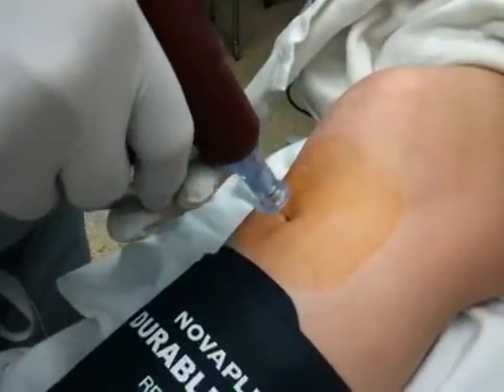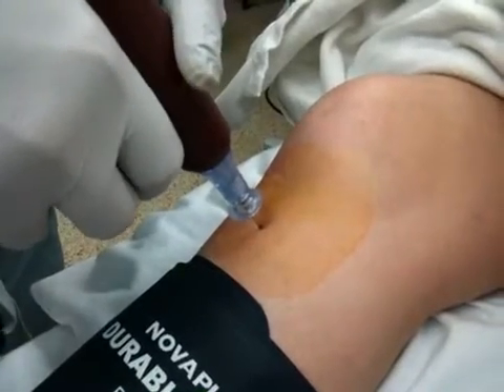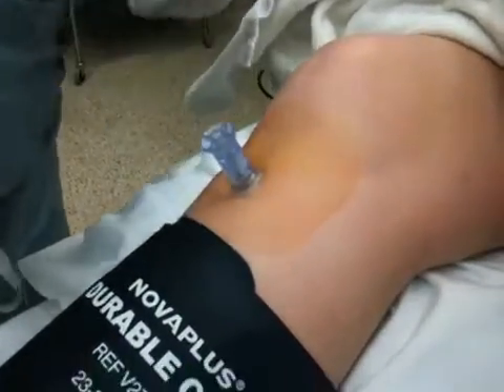I'm going to go through the skin. I'm touching the bone. You can still see at least one of the black marks above the skin. And we're in the bone.